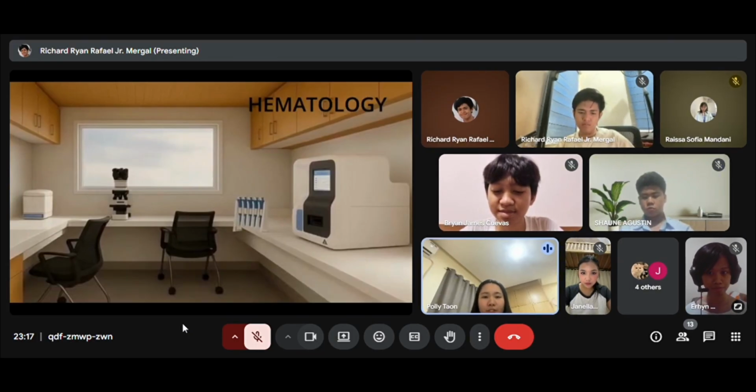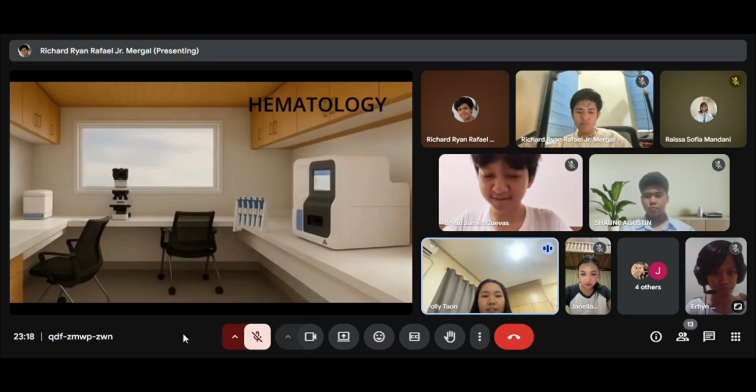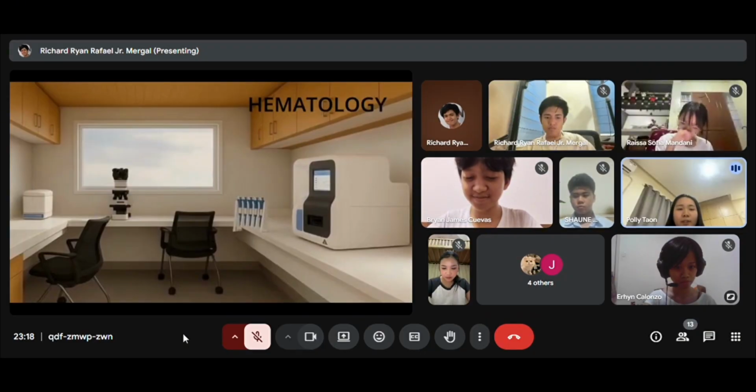Moving on to the procedures, the department follows a standard operating procedure to ensure safe and accurate specimen handling. Each blood sample receives a unique ID during accessioning for full traceability. During collection, phlebotomists use sterile technique, dispose of needles safely, and monitor the puncture site. The specimen is labeled immediately with complete patient information before leaving the bedside.